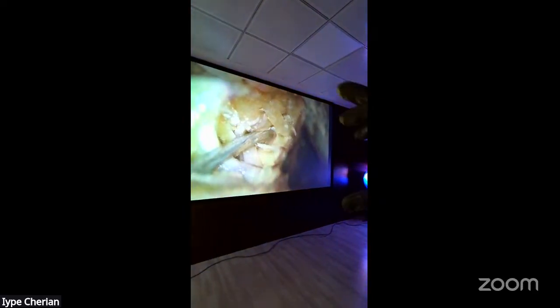Show it through the glass, this one. Looking through the glass seems more convenient. You can now see the dissection through the 3D glass and how immersive it is. The principle can be applied to a lot of things, like changing the screen. So John, this gives the option to look at it differently.